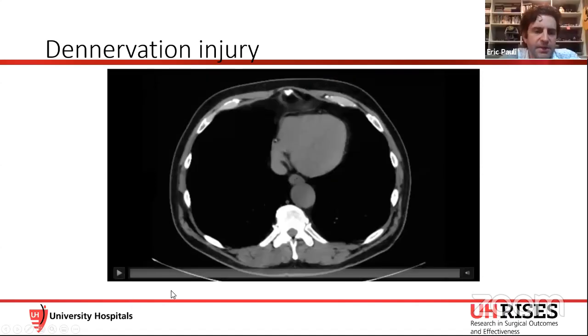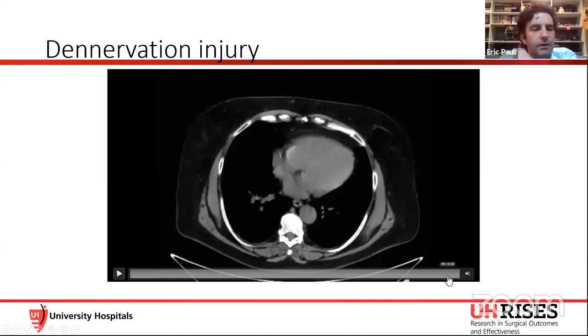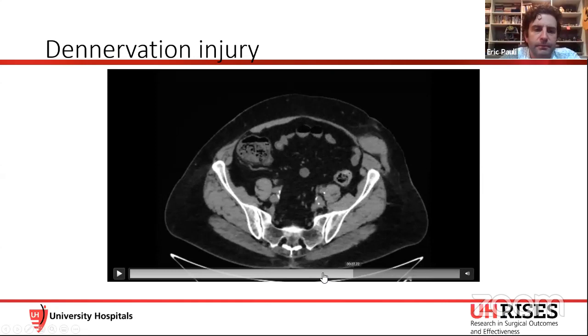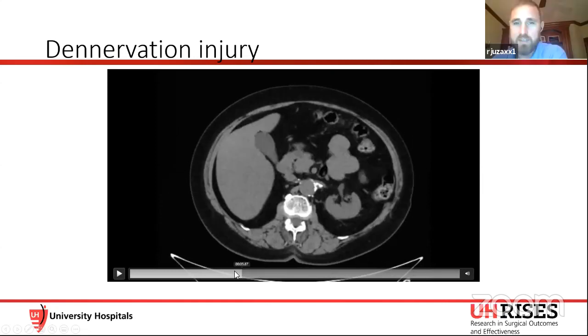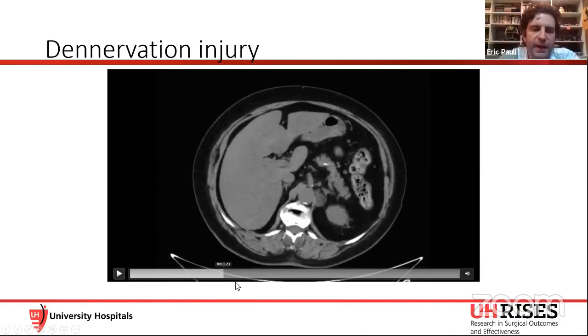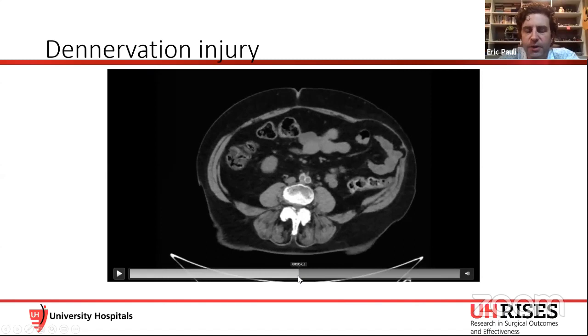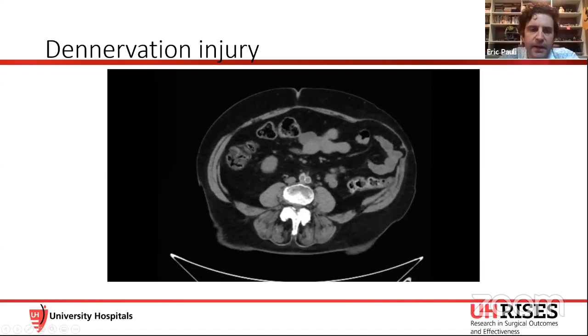Hey, Ryan, if I'm not mistaken, that patient also had, looks like, a AAA repair, yeah? Patient did, yep. Right, and so this gives an opportunity to point out the fact that the lumbar vessels on that side are also gone. And so as you think about this patient, not only do you have a denervation to worry about, but you actually have a devascularization of some of the lateral abdominal wall blood supply. So things to look at in addition to the area of denervation.